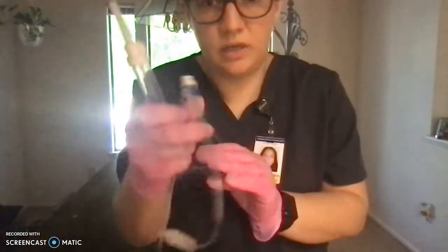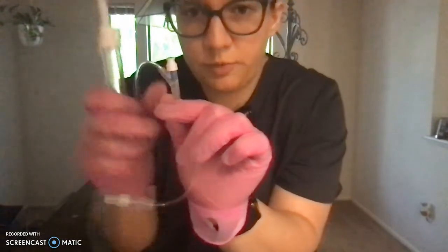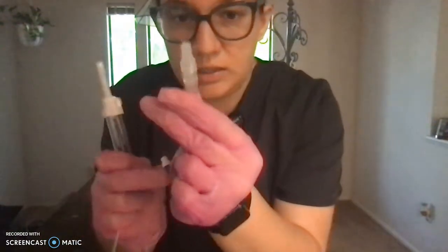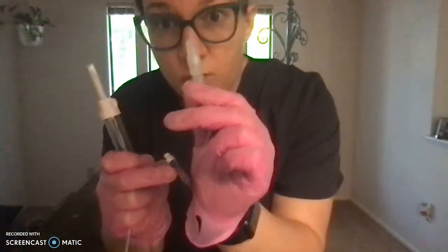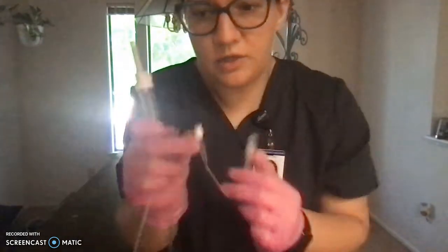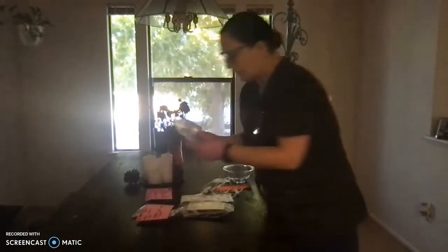Next is going to be the Y site. This is where you're going to place your piggyback. You're going to connect it there, or you can use it for other medication administration. This is the adapter end. It will connect to the catheter site of the patient. And I'll show you how we'll spike the bag.